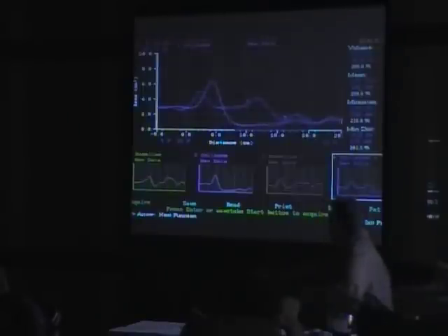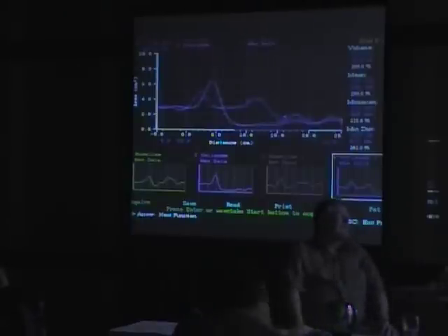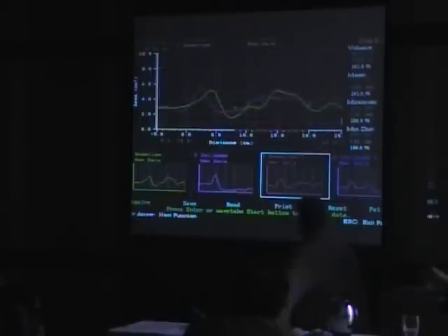And when you position your equipment, you have to be careful that they can't see the screen. Because you'll be right here, and they kind of want to go over here and see the screen. It's hilarious. But again, the assistants do all this. All these tests have been done by my assistants. I get the printed copy brought to me when I'm in with the console.